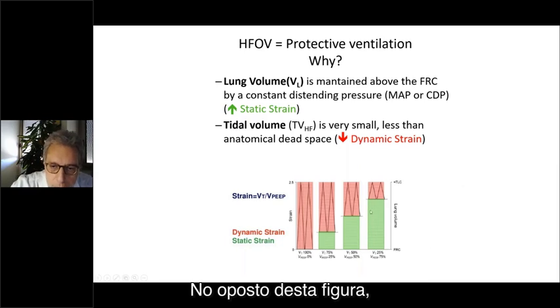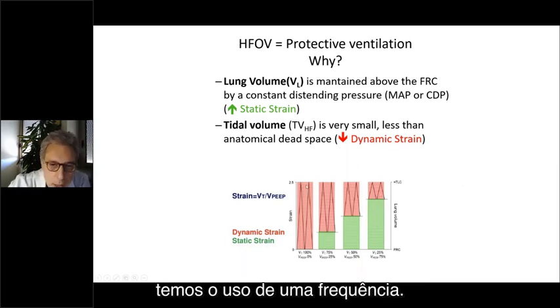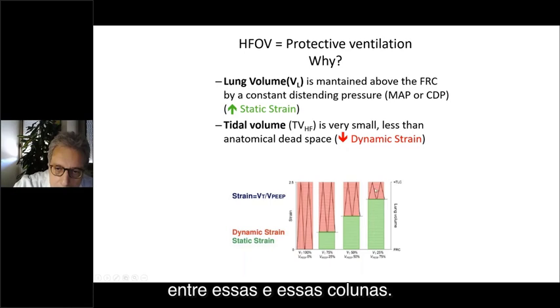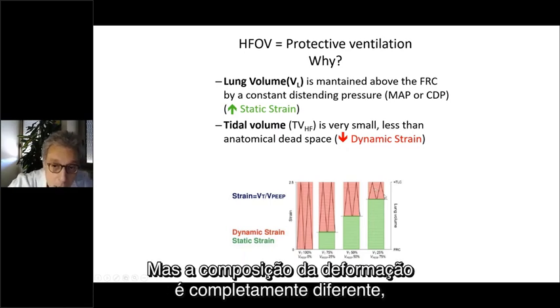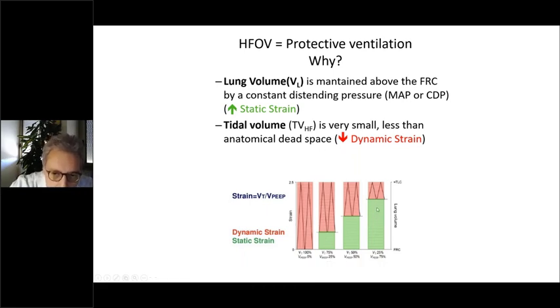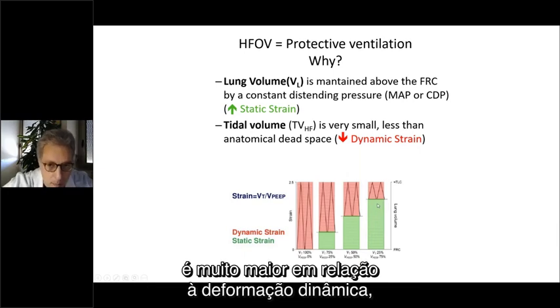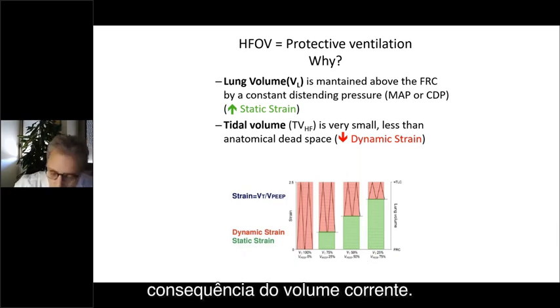On the opposite side of this figure, we have the use of high frequency. You see that the entire volume is completely the same between this and this column, but the composition of the strain is completely different, because in this way the static strain, the green color, is much higher with respect to the dynamic strain, a consequence of the tidal volume.